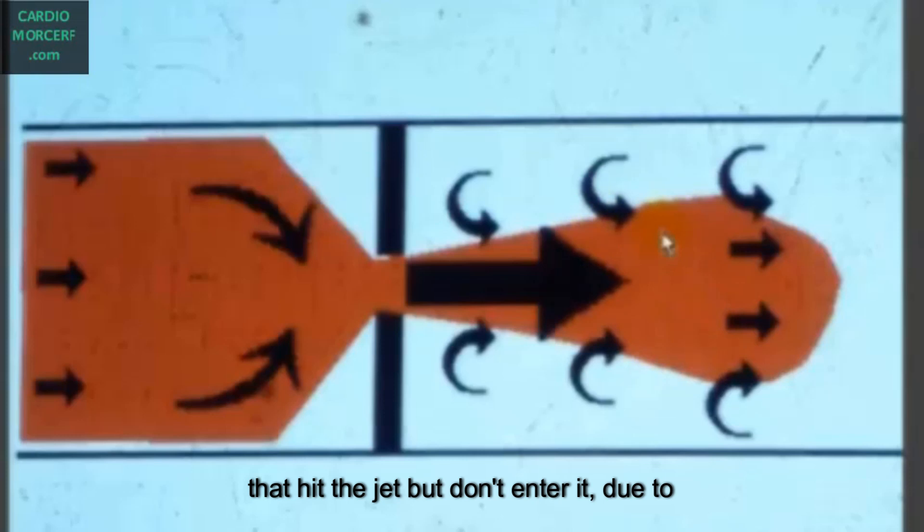The blood cells that hit the jet but don't enter it due to the angle in relation to the direction of the jet will spiral and rotate and turn around the jet, causing red cells in all directions and velocities. In other words, a turbulent flow. Notice that the turbulent flow is around the jet, but the jet is laminar until it finishes due to its mass increase.